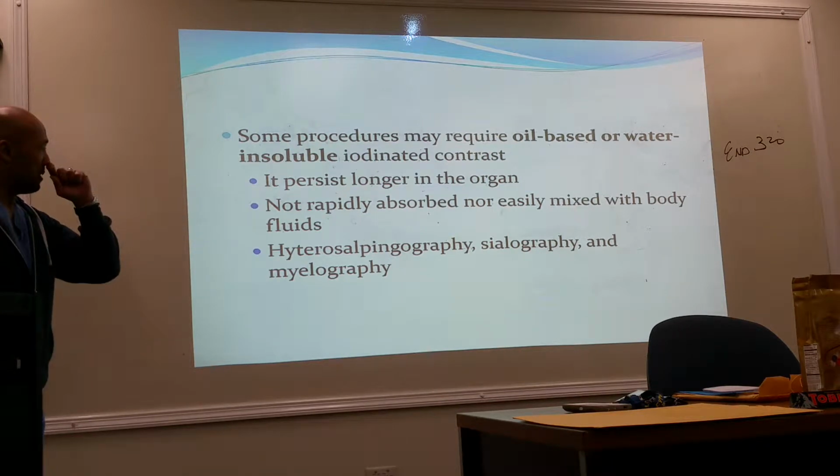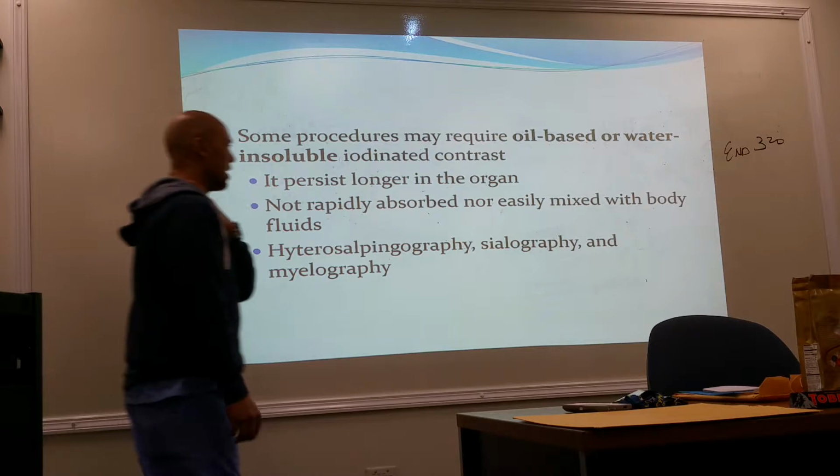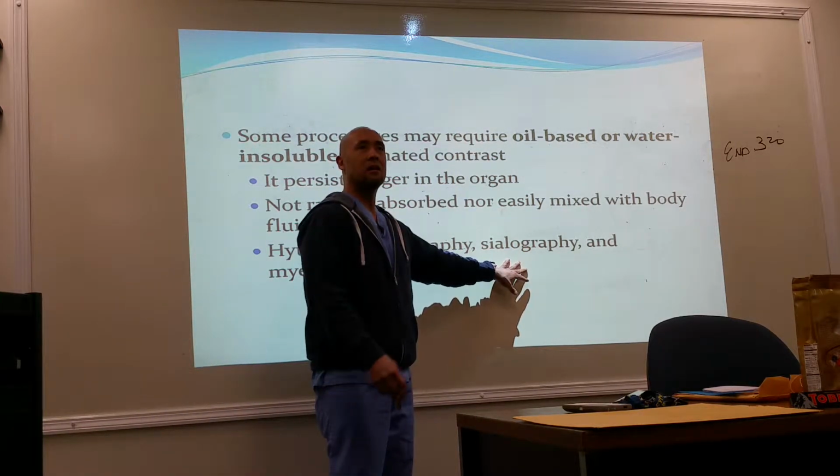Some places they use oil-based contrast for hysterosalpingographies. I don't even think they do sialographies anymore. You guys know what sialography is? Mm-mm. Okay.